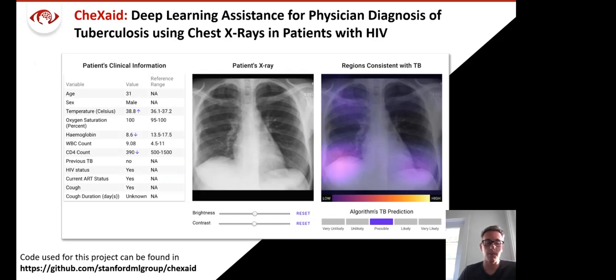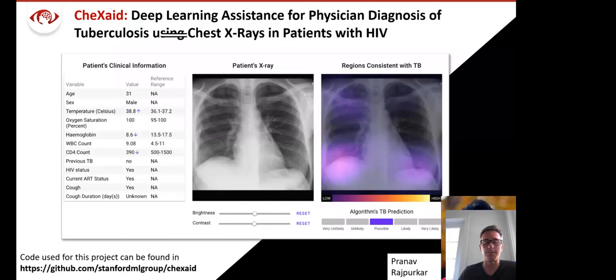And so this model, which is, by the way, currently available right now on GitHub, and you're welcome to explore it, allowed us to present the model to the clinicians right at the point of care, in a situation where there weren't a regular radiology group that interpreted for these people. And this is work led by Pranav Rajpurkar.